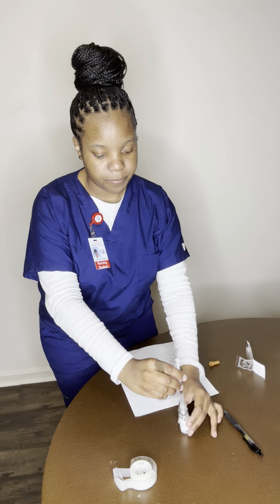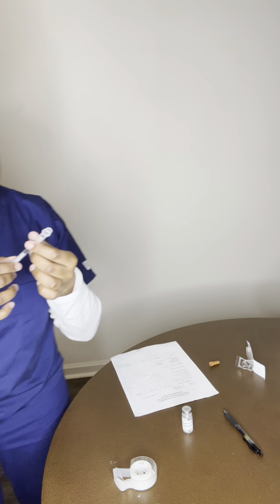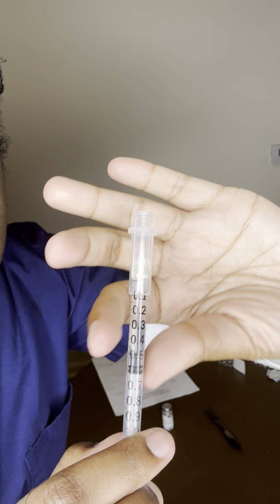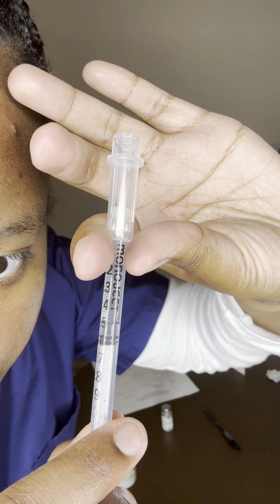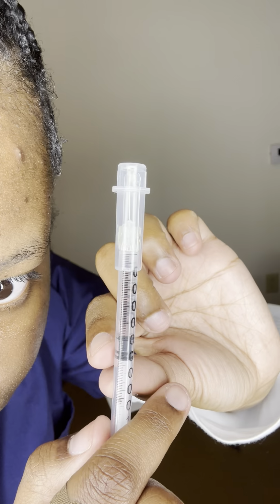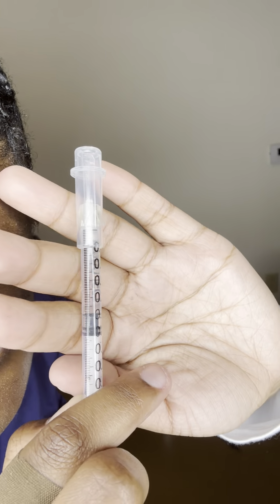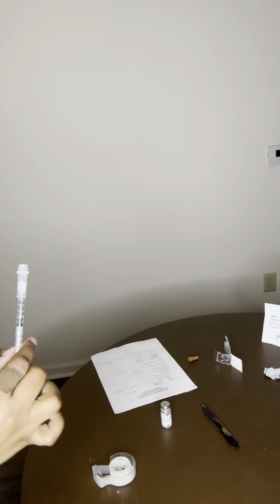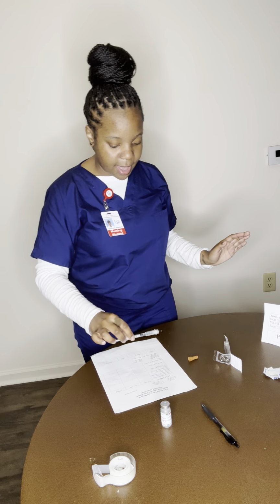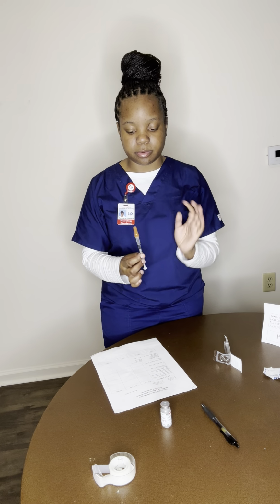Okay. I'm going to put my safety back on. As you can see, I have 0.5 milliliters. There you go. So now I am going to replace my cap using the scoop method. And I'm going to replace the cap.